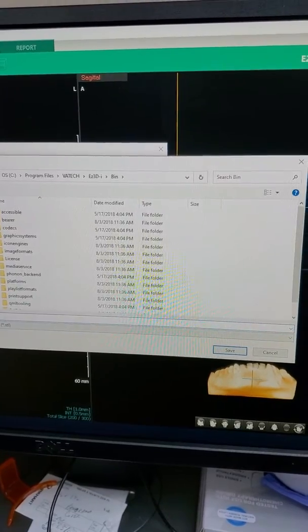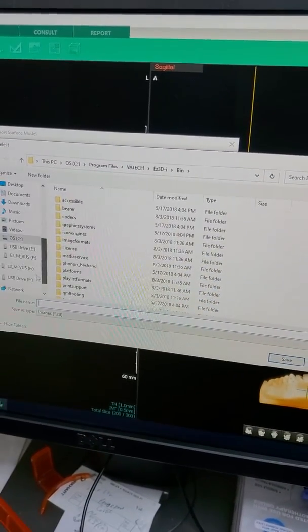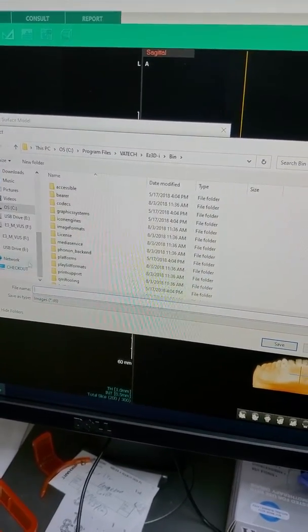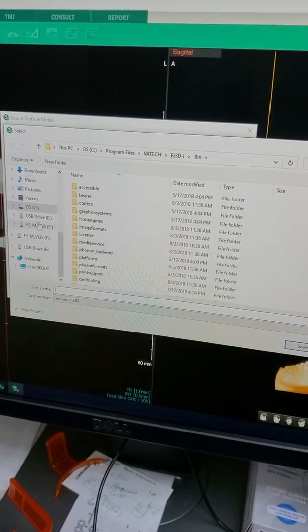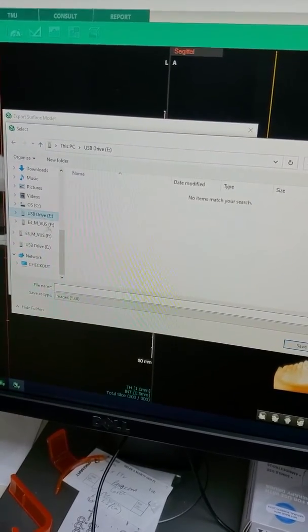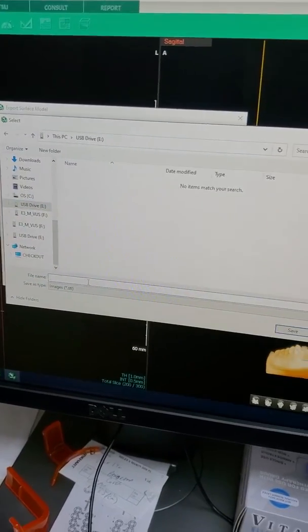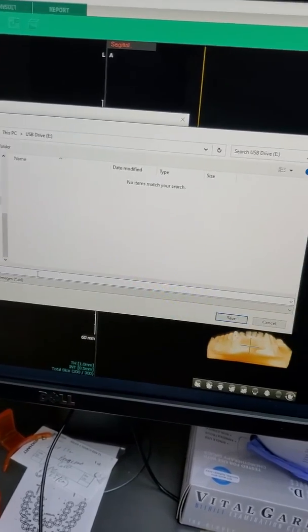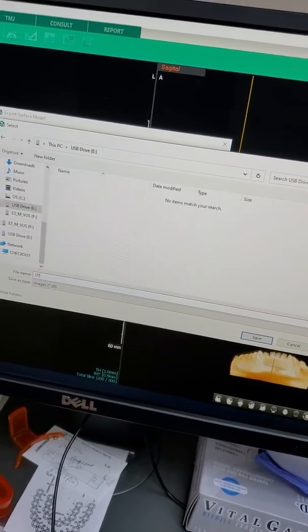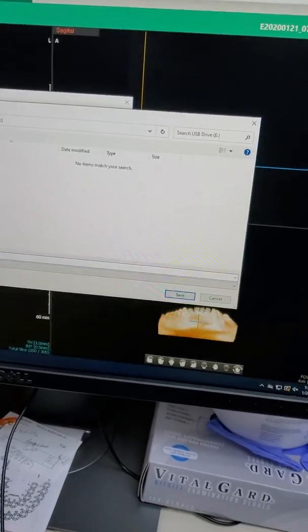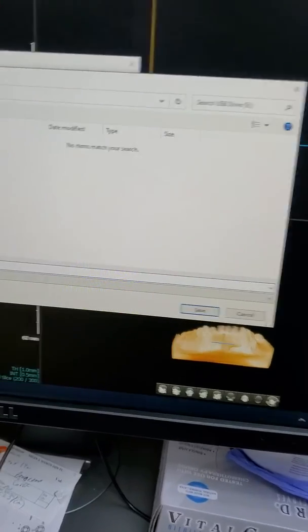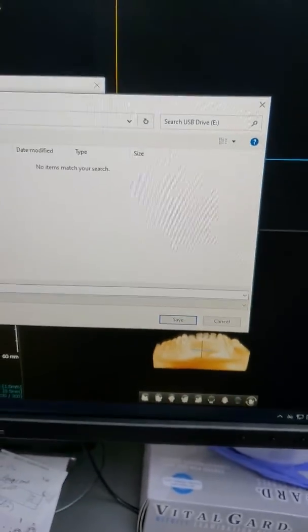Then we put in a USB drive, so we're going to scroll to the USB. I think it was E. Then we're going to put in the patient's initials and click Save. As you can see here, it's an STL file that we're actually saving.